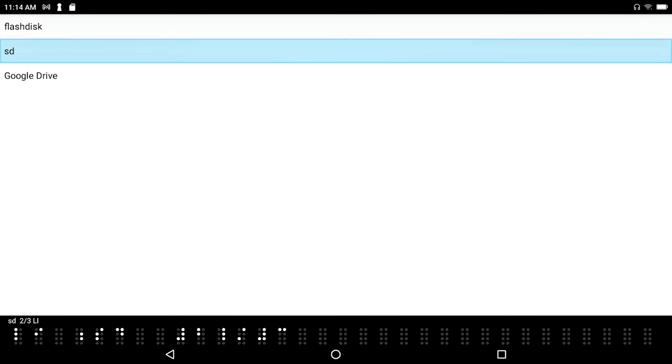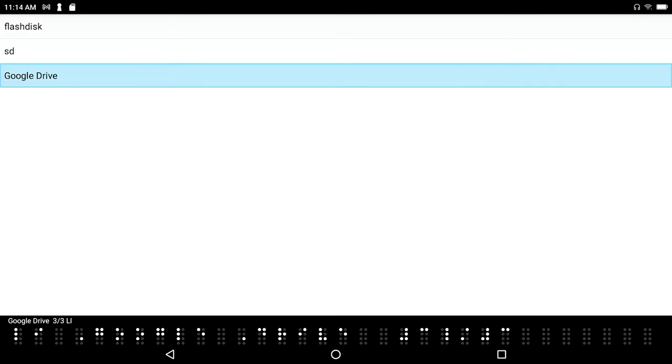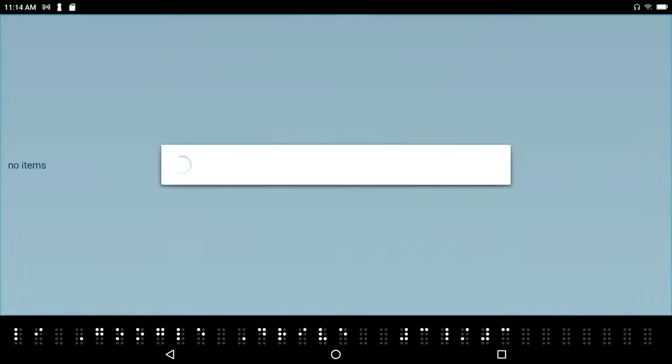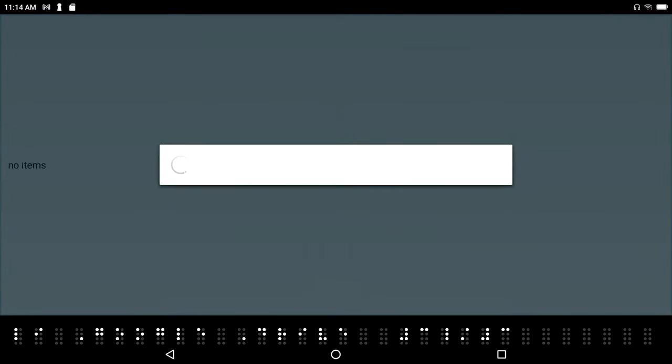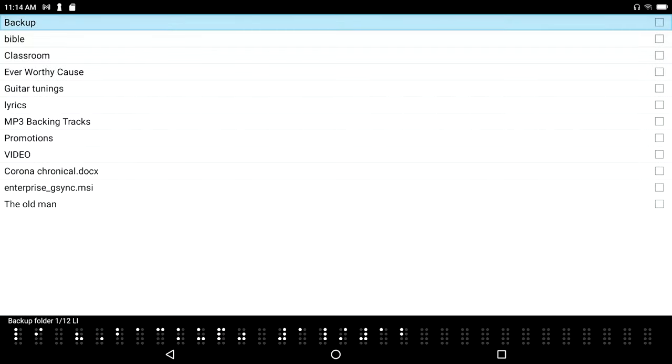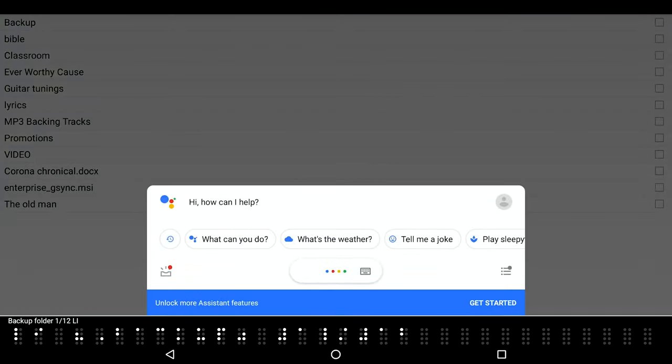And this time I'm going to go down to Google Drive. Backup folder 1 of 12 list item, there's one folder called backup. And let's just say that I'm going to just put it all here at the root level of my Google Drive. You can create folders of course in Google Drive, but for this demo.